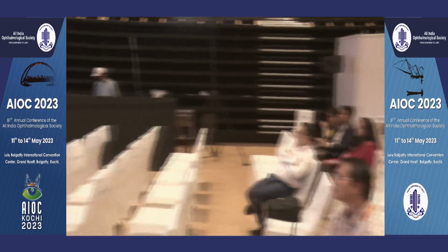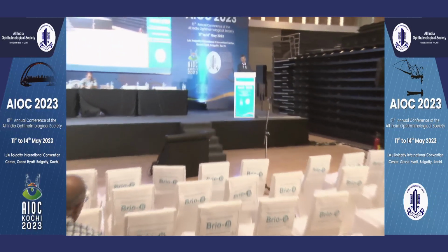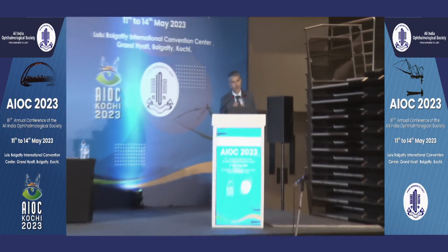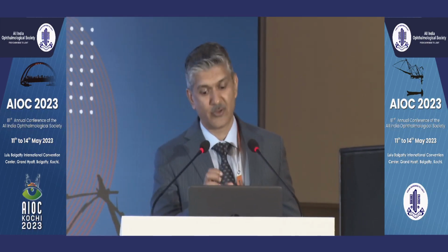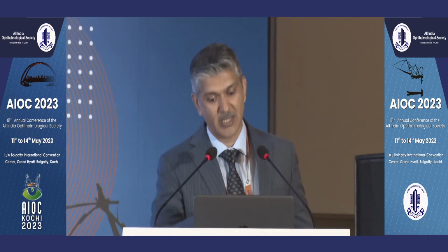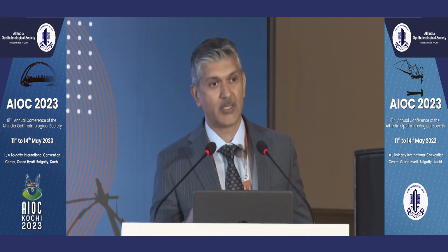See, you hold the lens at the optic haptic junction. If you hold it at the haptic, it's very thin. It's 50 to 100 microns, and it can tear. The thickest part is the optic haptic junction, so you get a good grip there. And I use the lens holding forceps. If you use a MacPherson, it will slip. So I use the lens holding forceps, which is serrated, so I get a good grip on the lens. And then you need to rotate it and twist it out, but it does not damage the optic, so that's not a problem.